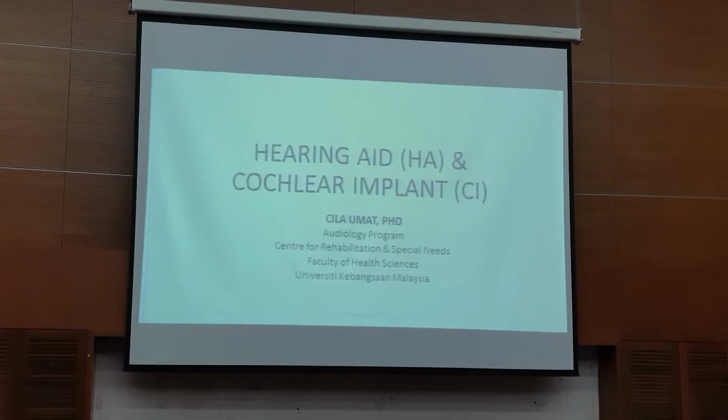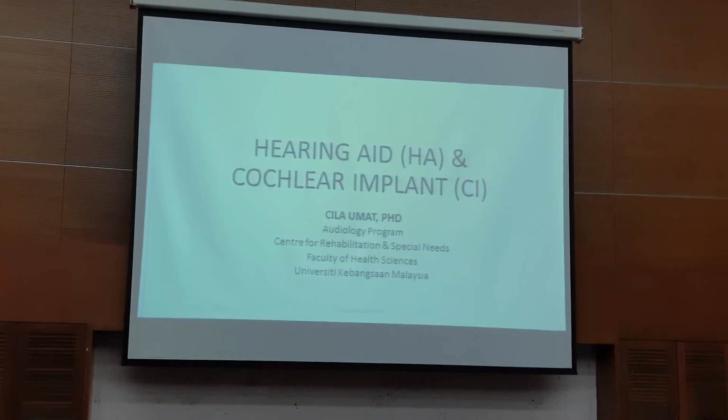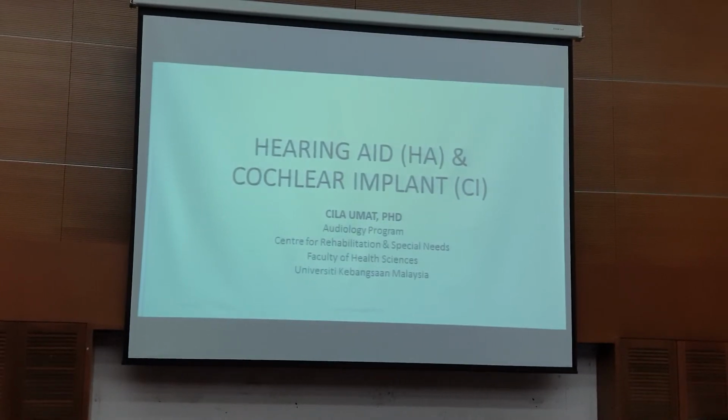Have to compare the interaural latency difference between the left and right side, besides the morphology.